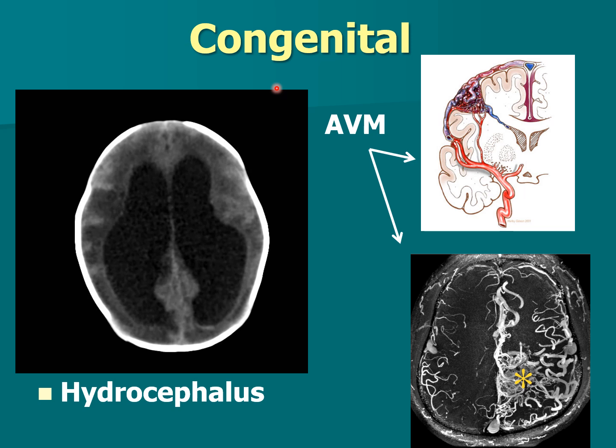Congenital malformations, I said earlier that the two that we would think about most often are an AVM, arteriovenous malformation. It's just where the arteries and the veins make something that looks almost like a nest. When you did this scan here, you can see that there's just a big nest of vessels. This can cause problems later in life. It's usually there from birth, but sometimes it grows as you get older. And then the hydrocephalus, these ventricles are huge, fluid filled, so there's very little brain tissue around this. This person has very little active brain tissue.